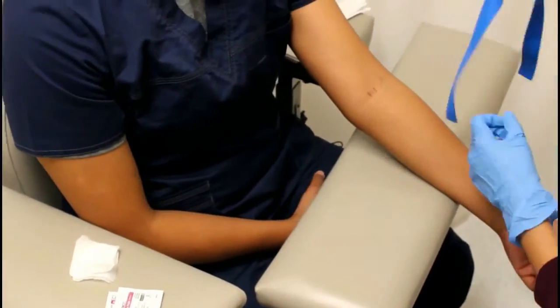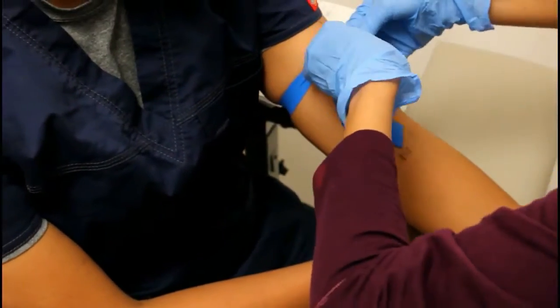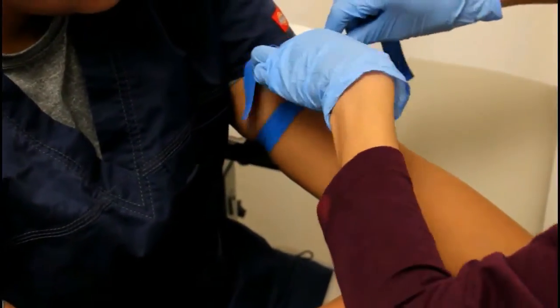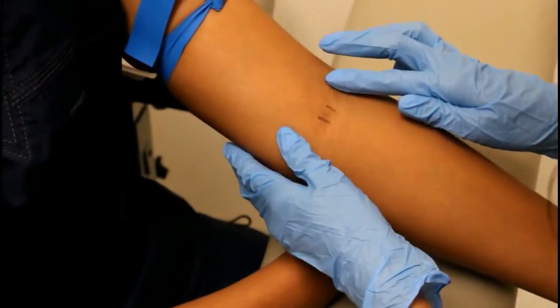Reapply your tourniquet following steps 1 through 5. Palpate if you need to.